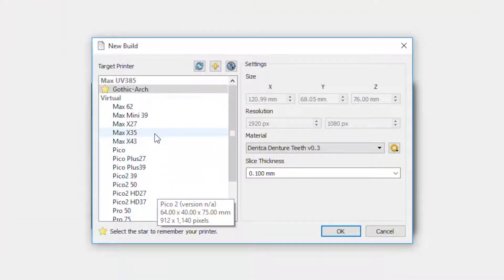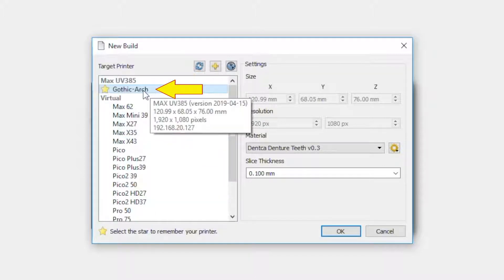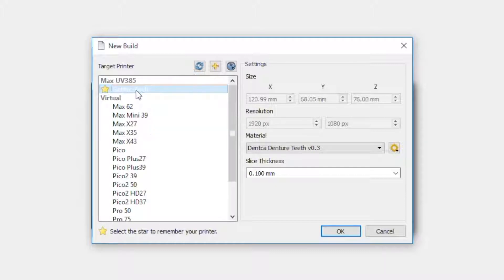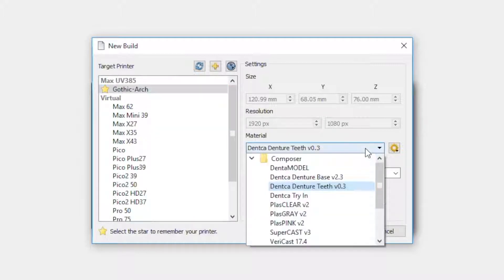Select the printer that will be used to print this job. Now pick the material to use for the print. For the bases, select Denture Base version 2.3.